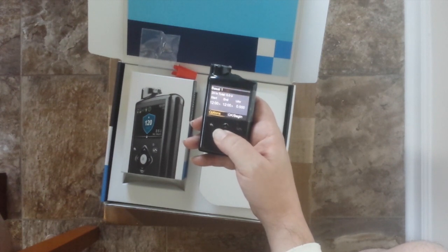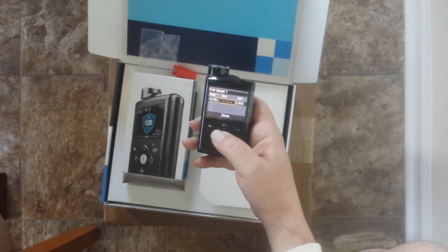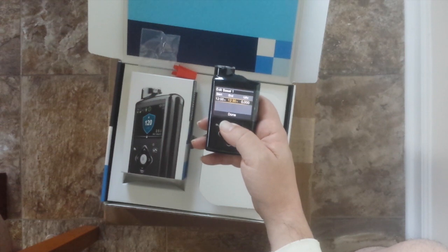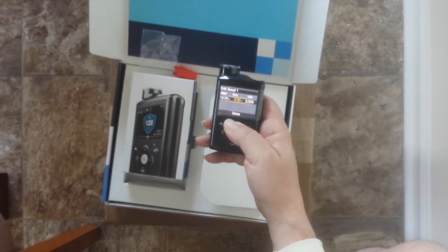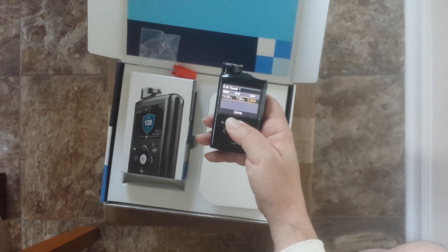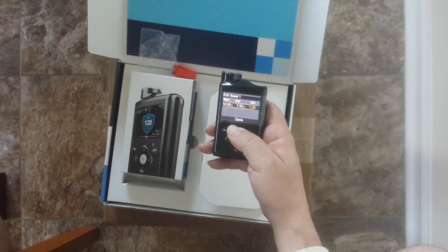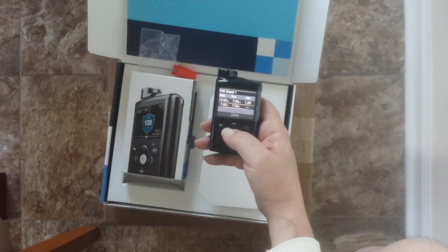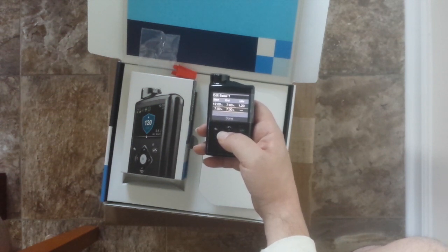Let me edit it — options, edit. Taking this from my notes: from midnight to 7 a.m. is 1.2 units per hour.